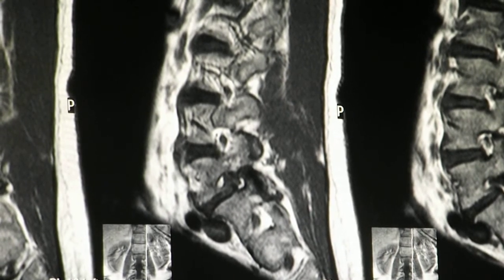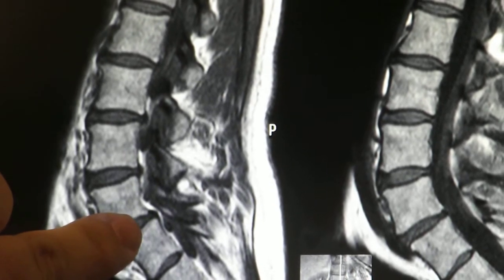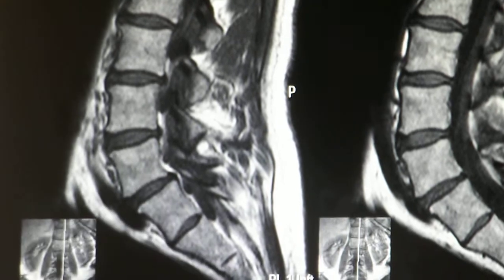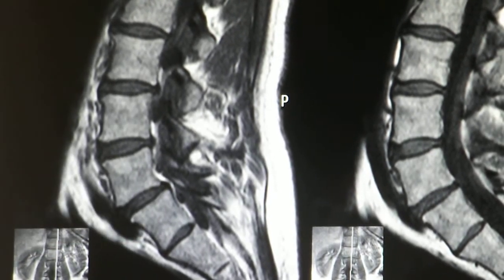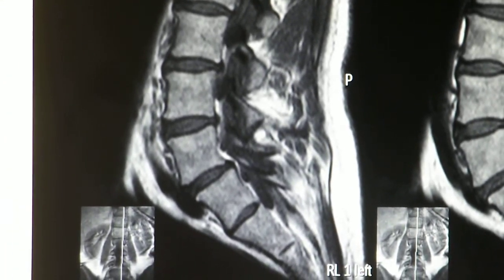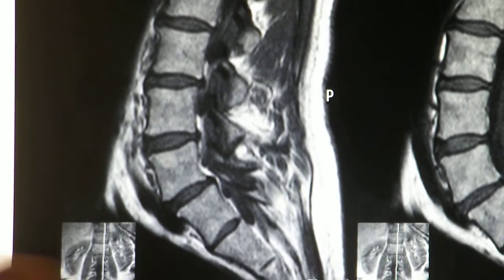There's multiple things going on with Miss Bowers' back. As you go through, we've got a little bulge here, we've got a little bulge here, and we've also got some slippage here. This is called spondylolisthesis. This is a grade 1, very, very common finding. I don't know if you'll be able to see this, but you can see the bone has slipped forward just ever so slightly. Whenever you have that, that creates an instability, and whenever you have instability, that obviously is going to cause more forces onto the discs. And the discs don't like that. They're not really designed for shearing motions.